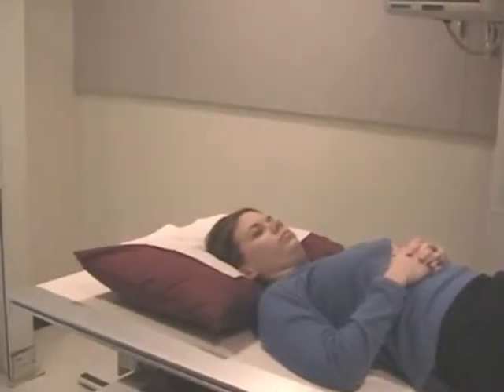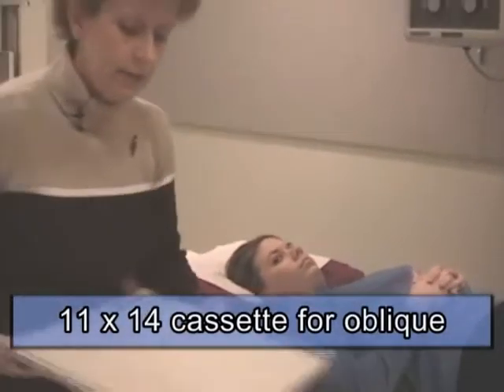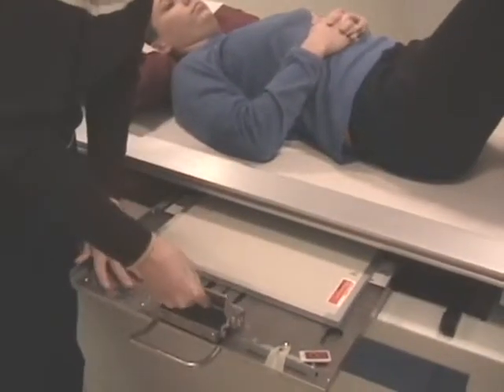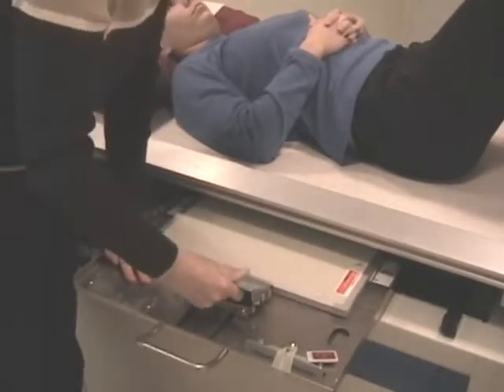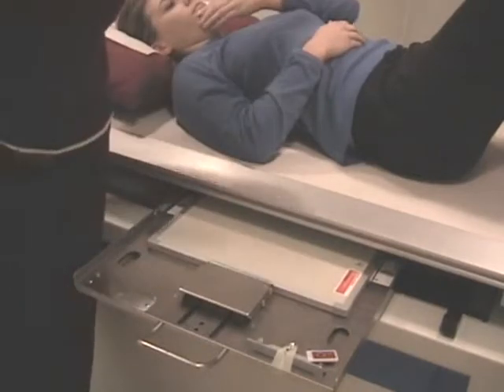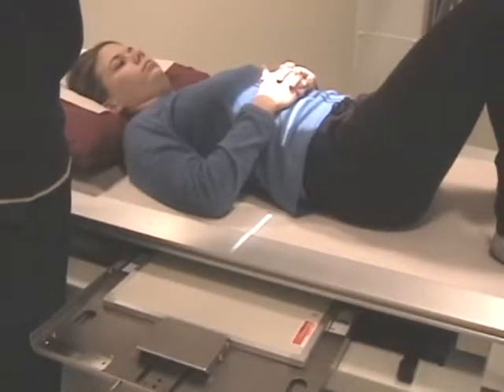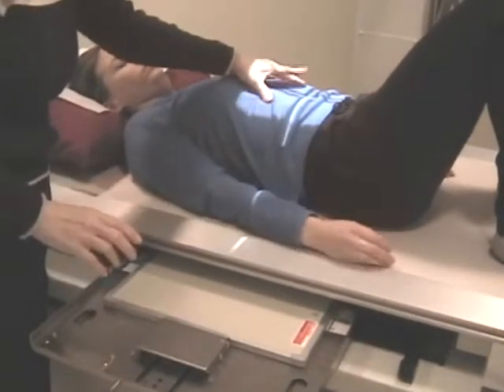We're actually going to use an 11 by 14 film for our obliques. I'm going to keep the ID blocker consistent. It's to the caudal end of the table. I'm going to adjust my collimator shutters to 11 by 14, and I'm going to come in side to side.